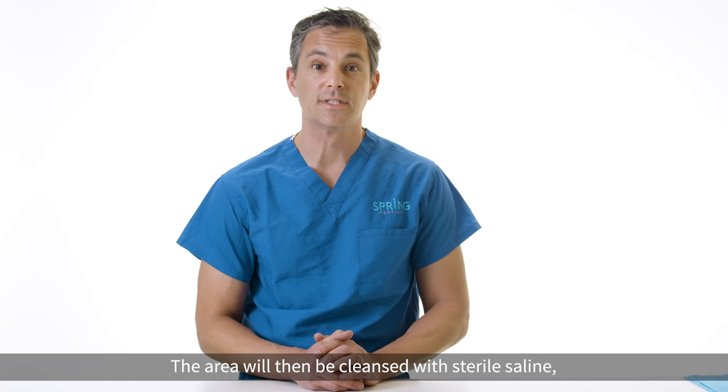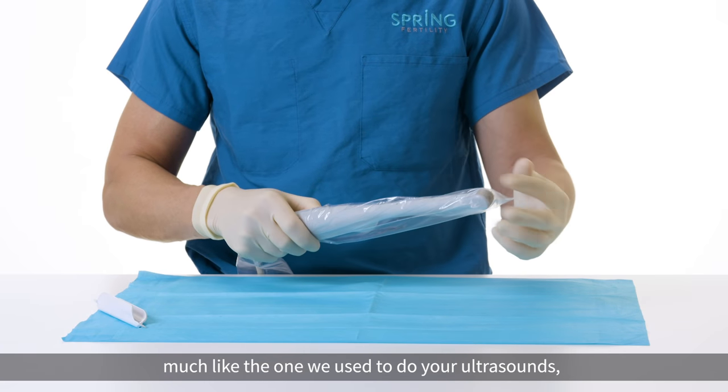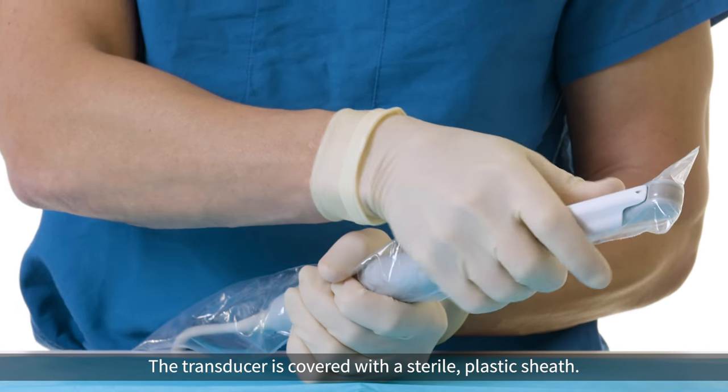The area will then be cleansed with sterile saline and the transducer, much like the one that we use to do your ultrasounds, will be prepared for the procedure. The transducer is covered with a sterile plastic sheath.